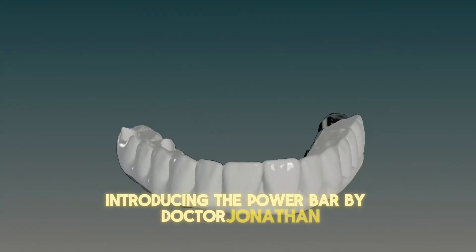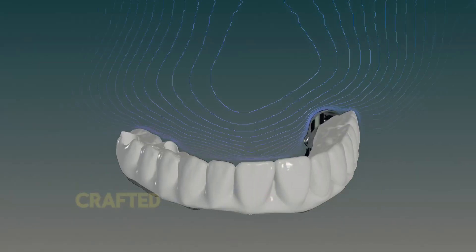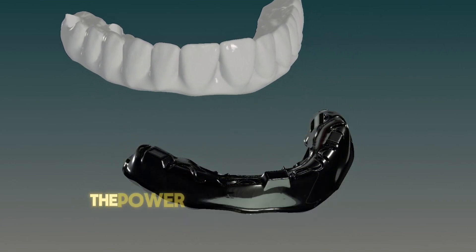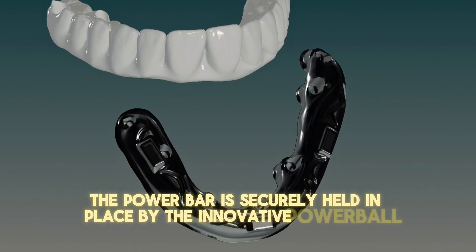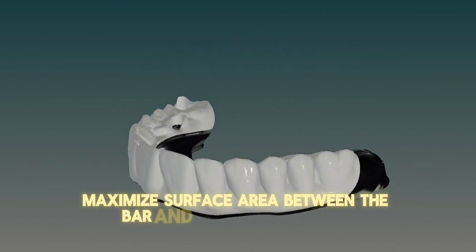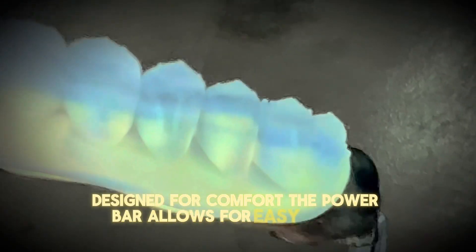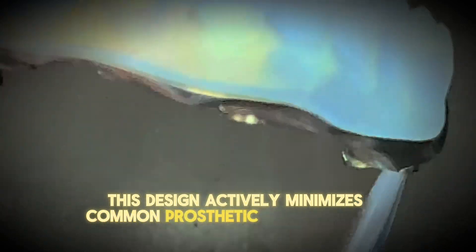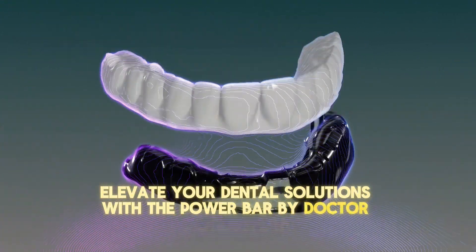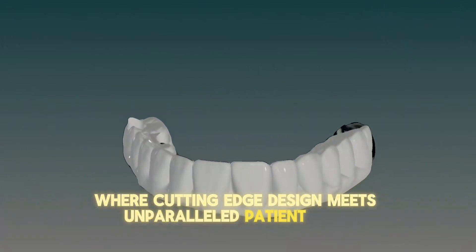Introducing the Power Bar by Dr. Jonathan — a revolutionary advancement in dental prosthetics. Crafted from high-grade Grade 5 titanium alloy, this lightweight yet sturdy substructure offers exceptional durability. The Power Bar is securely held in place by the innovative Powerball 2.0 screw. Its unique tripod retention and sigma curve geometry maximize surface area between the bar and its superstructure, enhancing stability and performance. Designed for easy milling, it actively minimizes common prosthetic complications.